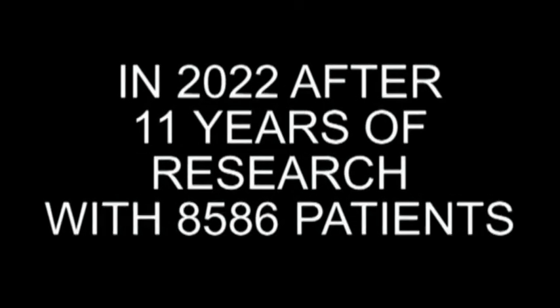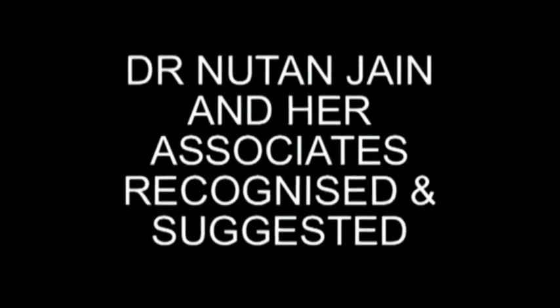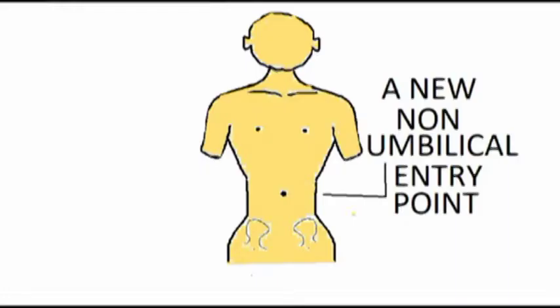Then in 2022, after 11 years of research with 8,586 patients with one or more previous surgeries, Dr. Jain and her associates recognized and suggested a new non-umbilical entry point for laparoscopic surgeons. We will discuss this very substantial study in some detail in this short documentary. But first let us see where this point is situated, which is now known as the Jain point.